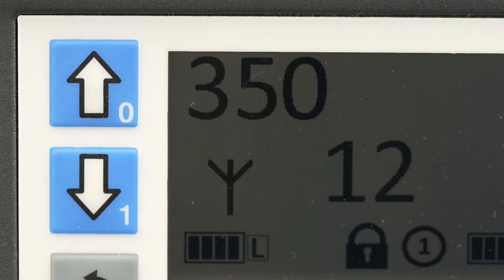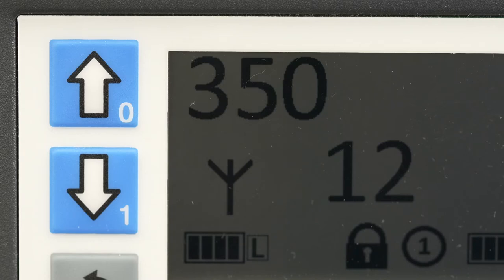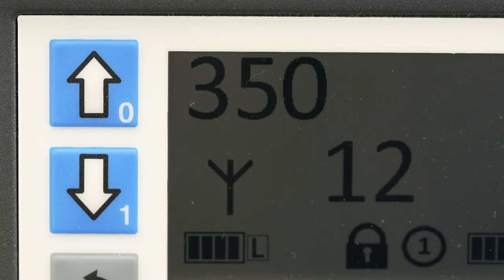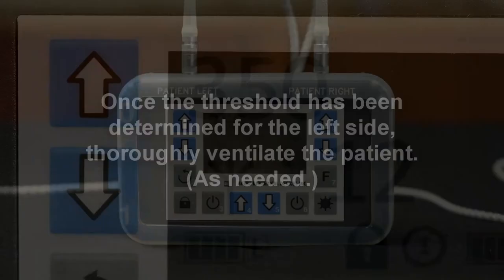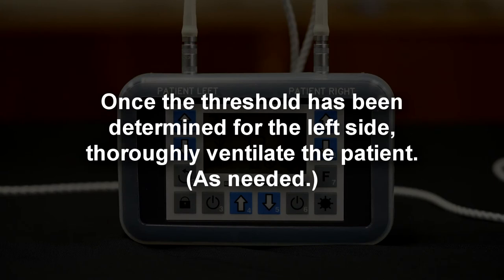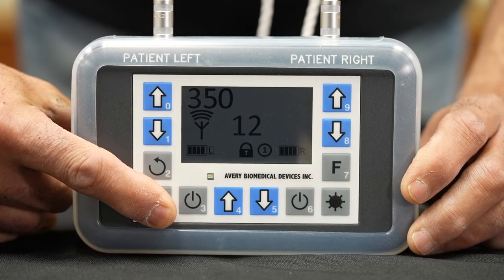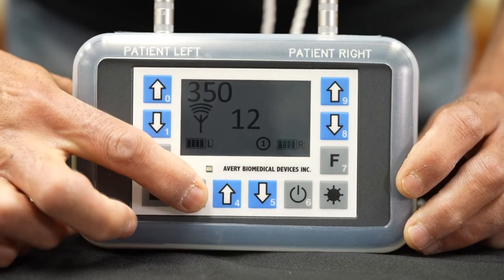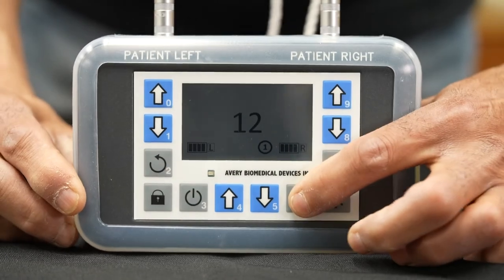Stimulation occurs when the three-wave icon over the antenna icon appears — this is the inspiratory period. When the three-wave icon disappears, that is the expiratory period and there is no stimulation. Once the threshold has been determined for the left side, thoroughly ventilate the patient as needed. Then turn off the left side of the Spirit and repeat the above procedure, starting at step four, to determine threshold for the right side.